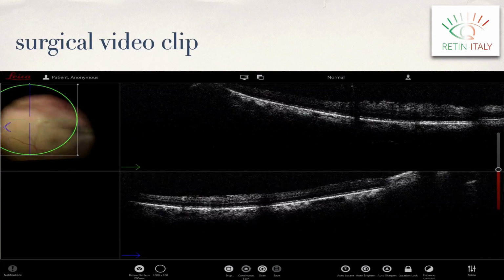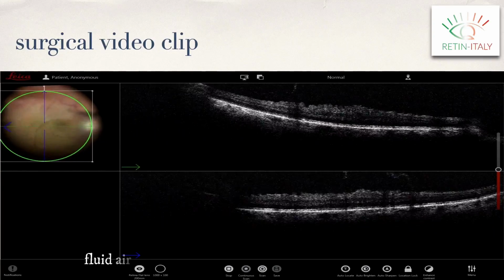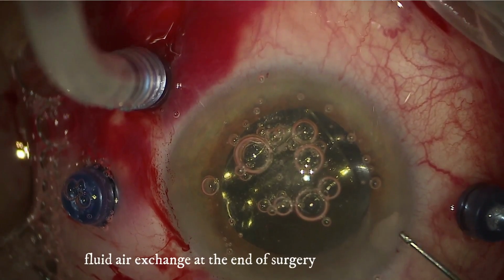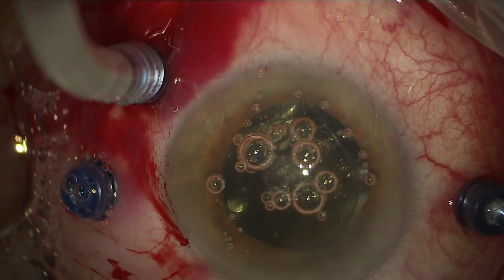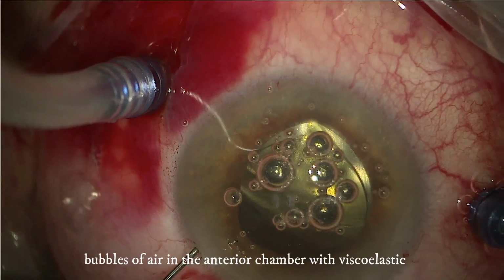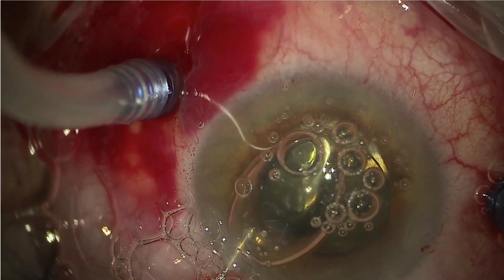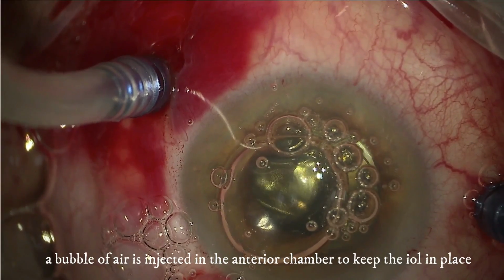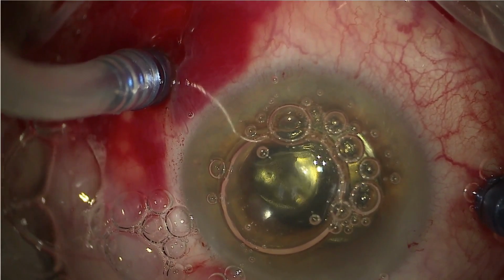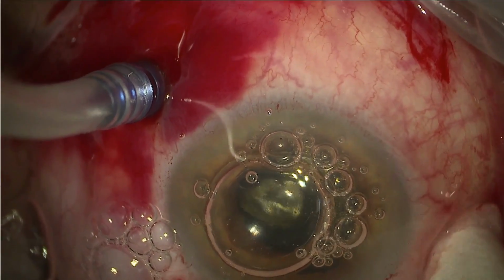And surgery is finally completed with fluid air exchange, injecting air in the posterior chamber, in the vitreous chamber. You will see that even during this maneuver, the pushing effect of the air tends to luxate the IOL in the anterior. So now I know what happened.